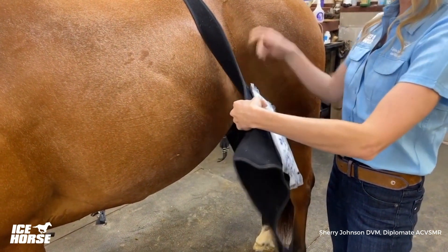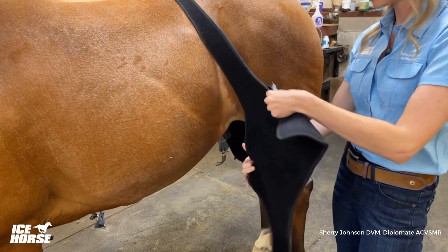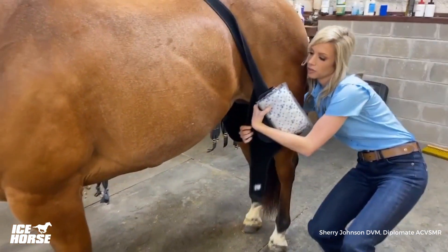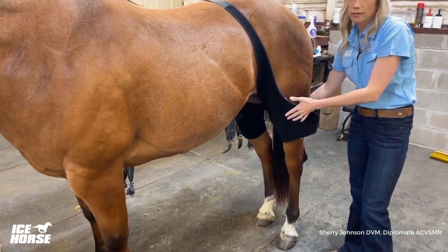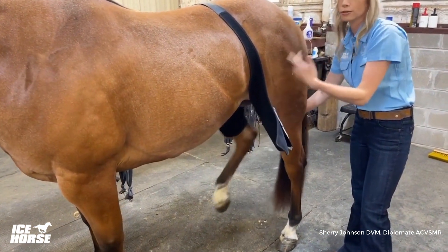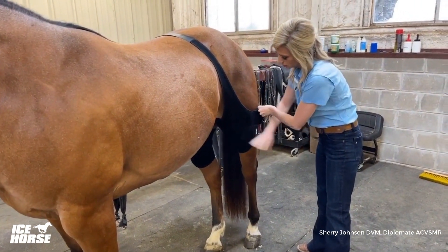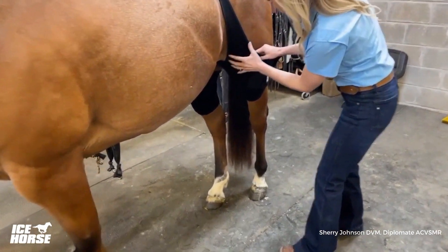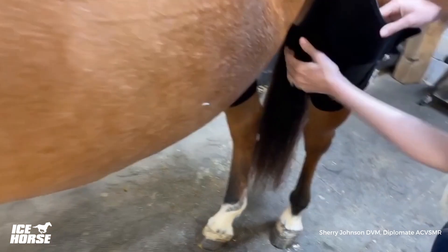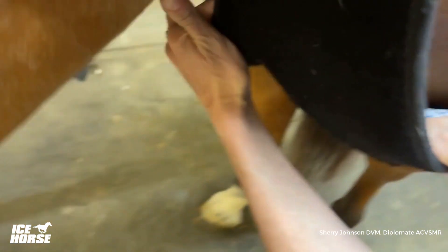Once I get my ice in place — and the other stifle is already in place — this is a pretty cooperative horse, but if you're doing this for the first time you always want to have a handler and be safe. Then I go ahead and get it strapped in with one easy strap and you're ready to go. You can see we've got nice femoropatellar joint coverage and coverage on the inside as well.